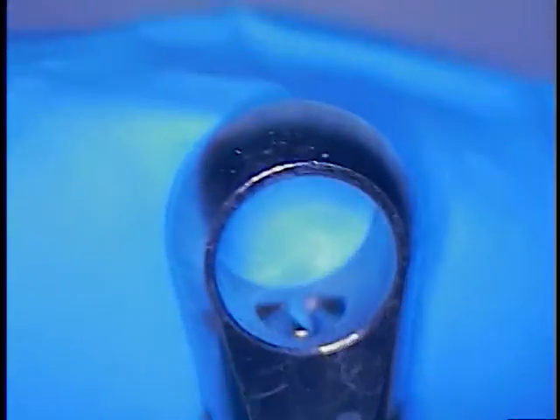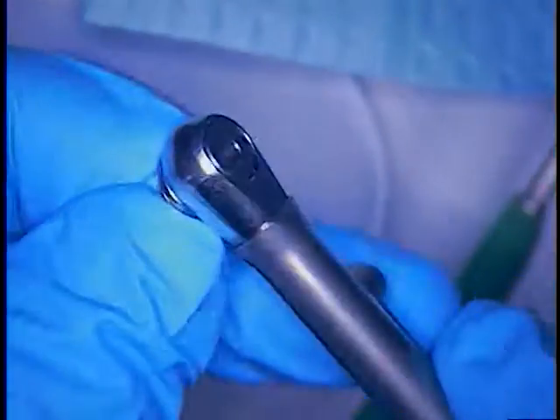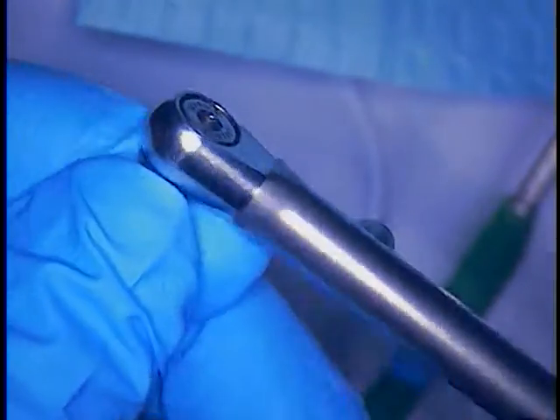I'm going to go ahead and get my driver now and wrench, put it all together. Snap that together, make sure we're going in the reverse mode. So it's clicking to the right and reverse, counter-clockwise. We can also measure pressure going in reverse as well. So in through the mirror it's going to look like clockwise, but it's really counter-clockwise.